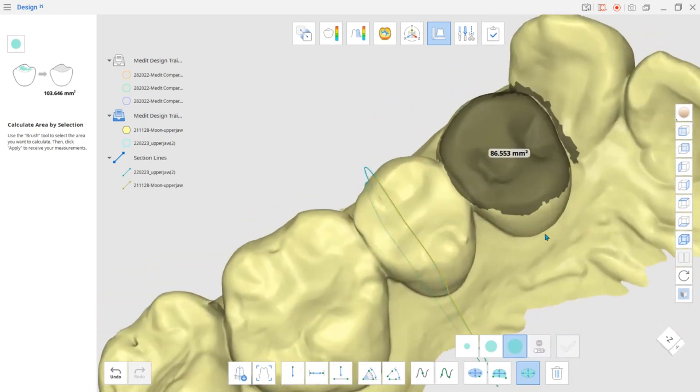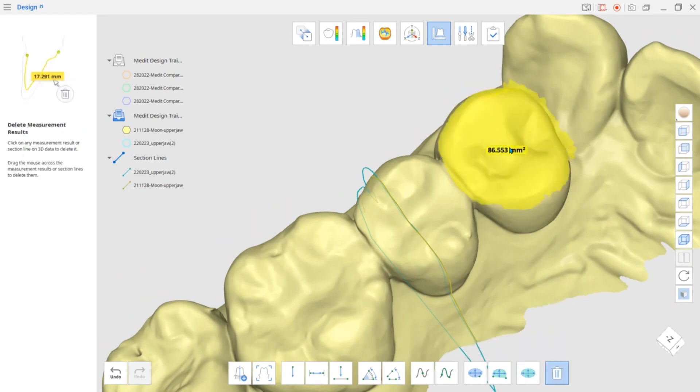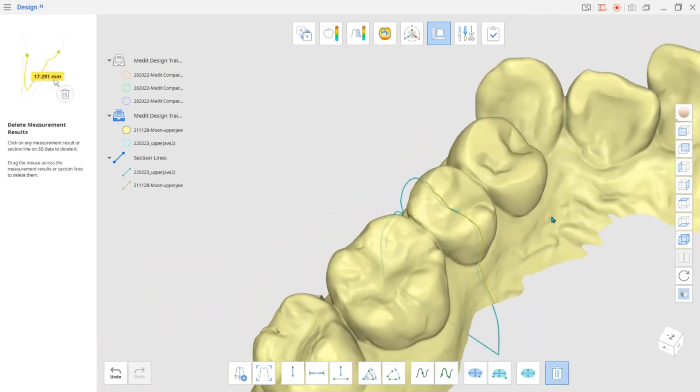Select Delete Measurement Results at the bottom and click on the annotations you want to erase.